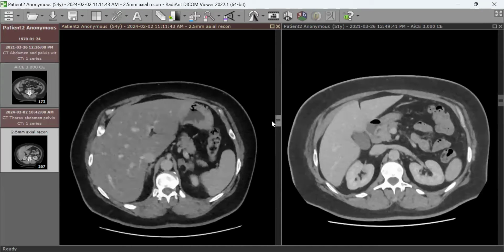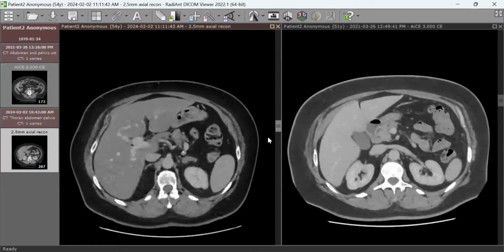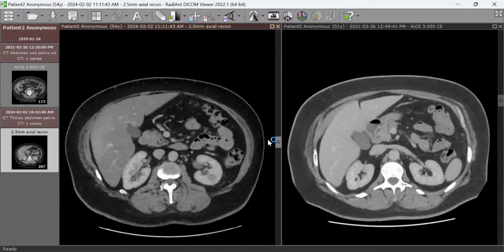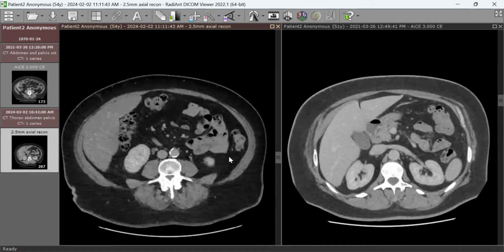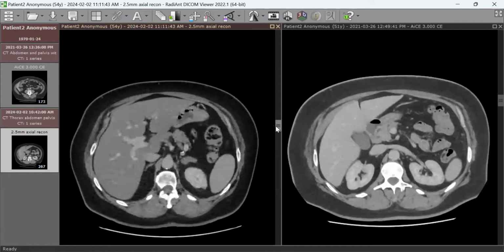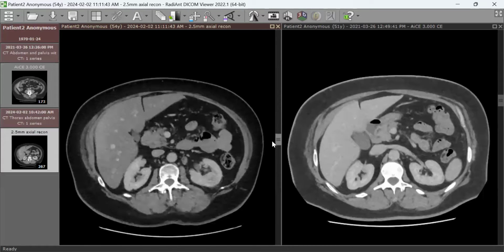If it goes outside the kidney, will that change the staging? Look at the perinephric fat. If it extends to the perinephric region or involves the pelvicalyceal system, renal sinus or the segmental veins, that will be T3. But if it goes beyond Gerota's fascia or involves the adrenal, that's T4, right? Yeah. And if it involves the adrenal without direct extension, that will be a metastasis.